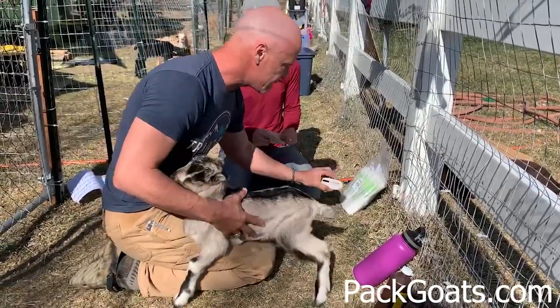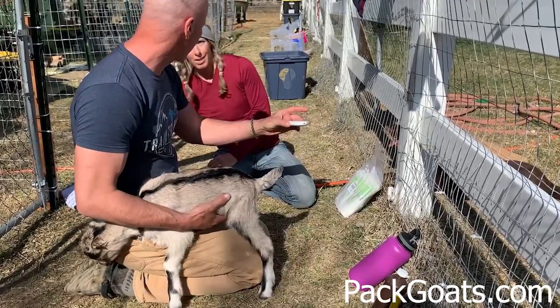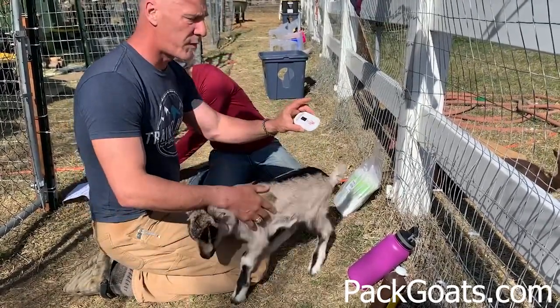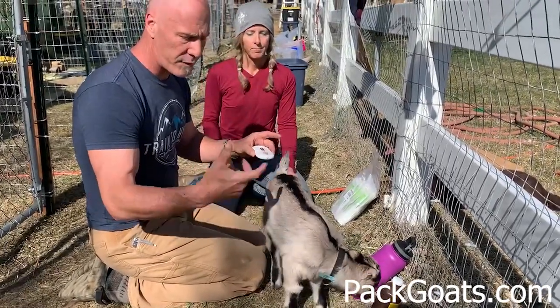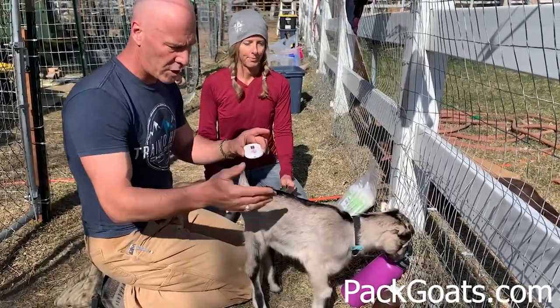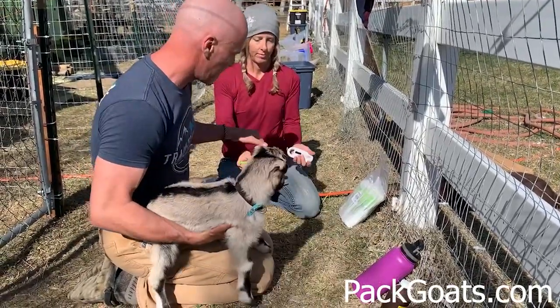So we highly suggest that you use these — it's what we're going to. This is the reader, super simple. This one costs like $45 for the reader. And then these run around $6.50 for each chip itself, and you can order them individually for your herd. Really super cost effective and just a great way to go.